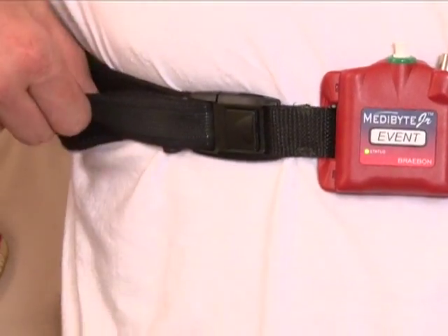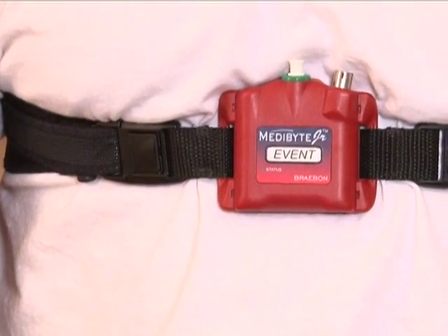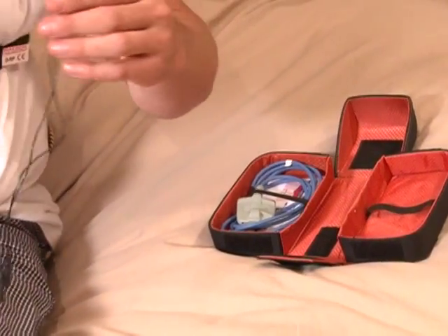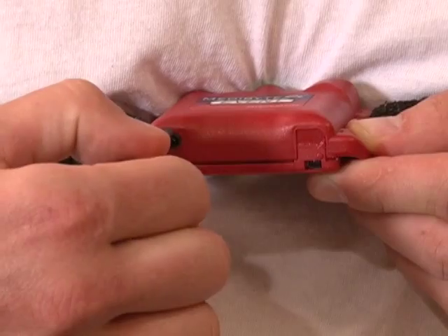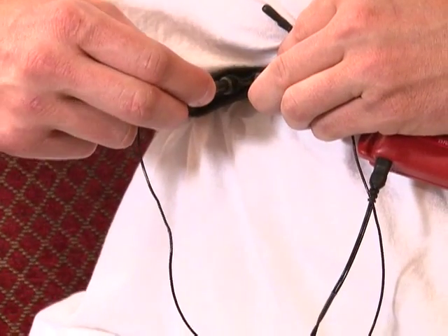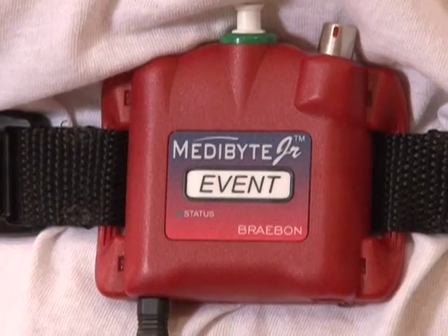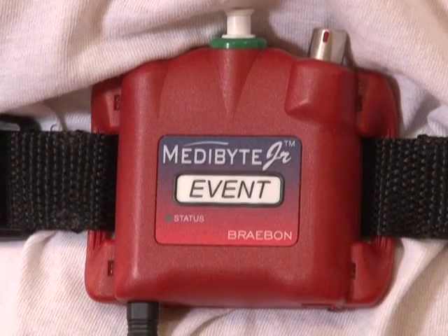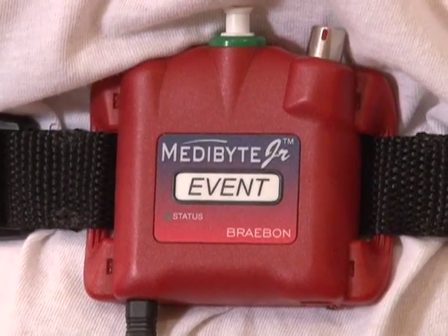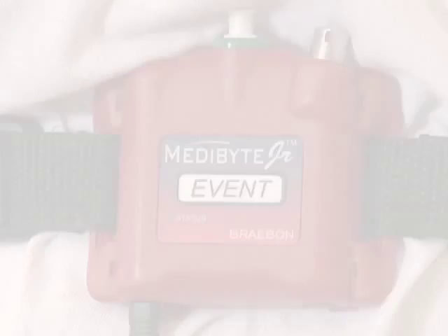If the effort belt is loose, simply adjust the strap so that it fits snugly enough that it will remain in place while you're sleeping. Now connect the belt sensor cable to the bottom of the unit and then insert the other two ends of the cable into the plugs located on the belt on each side of the Metabyte unit. Observe that the green status light located on the front of the unit is blinking — this is an indication that your unit is programmed and operating properly.